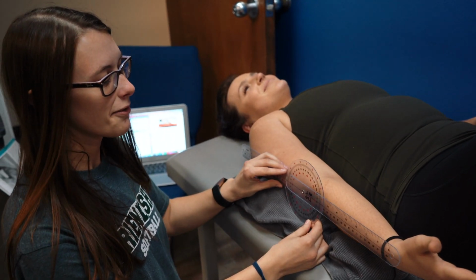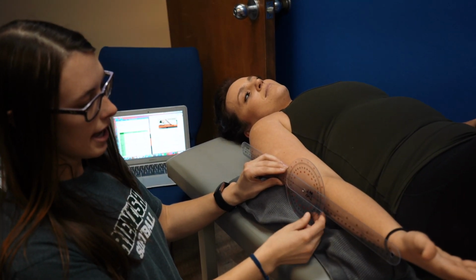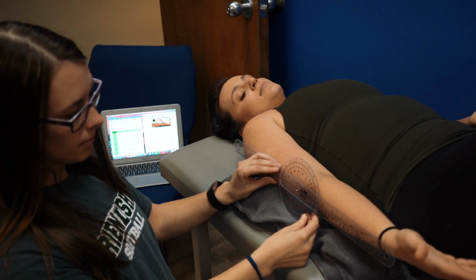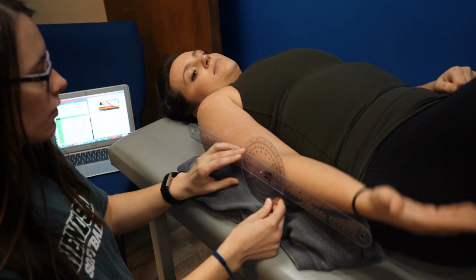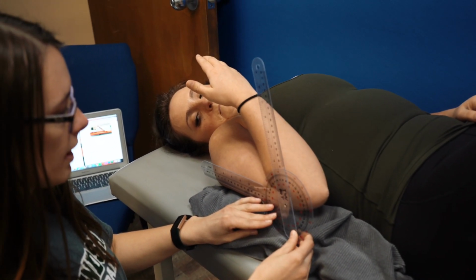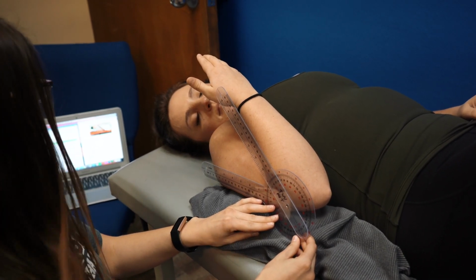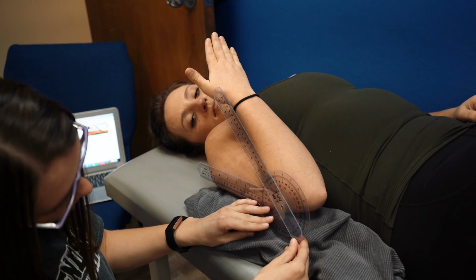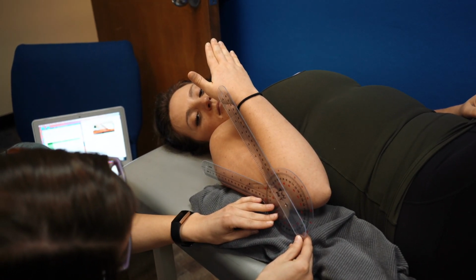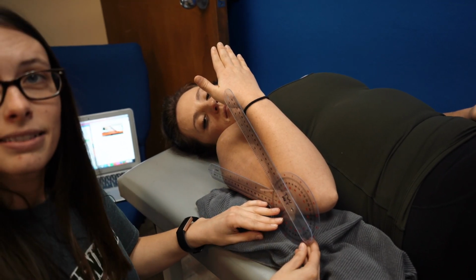So we're doing elbow flexion, and I have Kennedy's arm straight with support underneath her arm. And we have the fulcrum aligned with the lateral epicondyle of her elbow. So go ahead and flex for me. The normal range is 140 to 150. And the moving arm is supposed to line up with the radial side of her arm. So right now she's at 138.